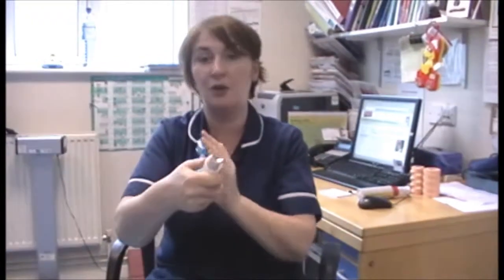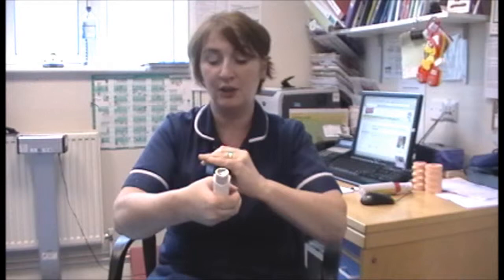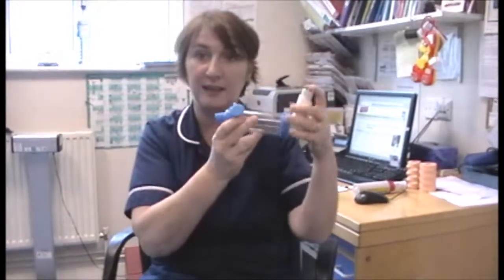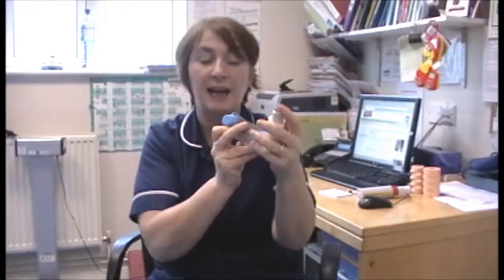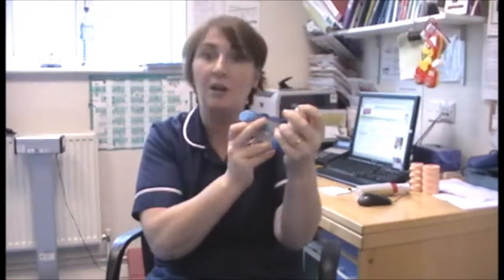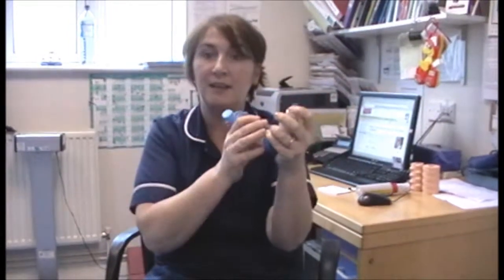Pop it into the base of your spacer like that. This is a universal one, so it will fit even if it's a round shape. Then what you need to do is depress this — this is going to be in my mouth — and I'm going to have a nice tight seal with my teeth and lips. As I depress it and push it down, I'm going to breathe in nice and gently.